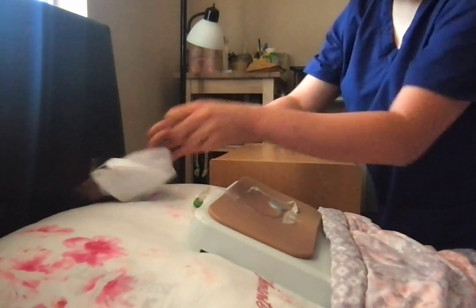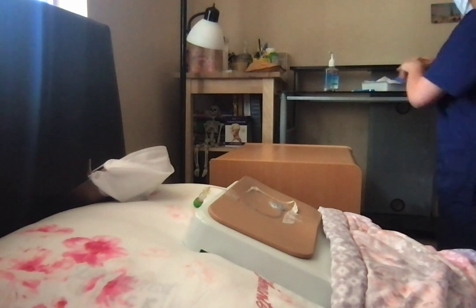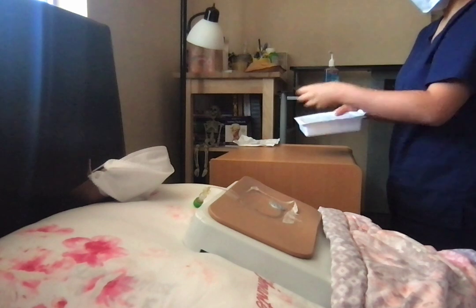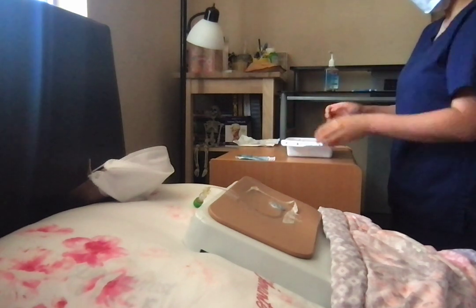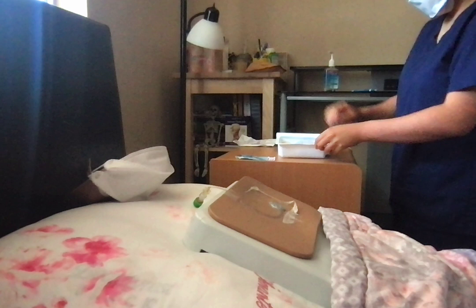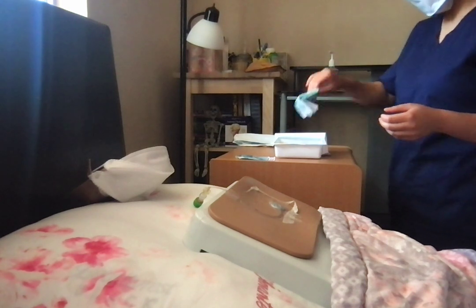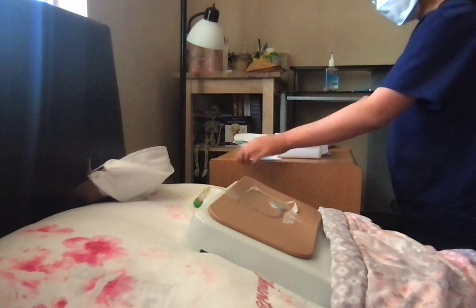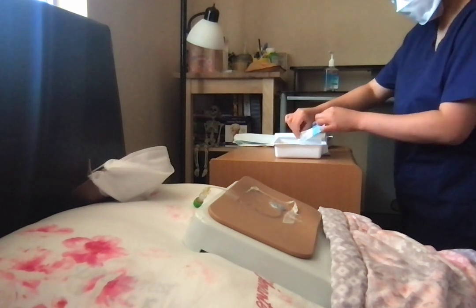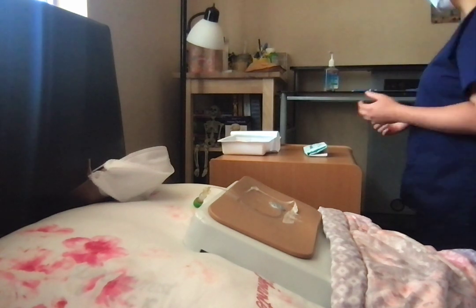Now that your head is turned to the side, Mr. Jones, I will perform hand hygiene. Now I'm going to prepare my supplies. I have my spare pair of sterile gloves, I have my bio patch, and I have my dressing kit. I'm going to open the tray and put the mask provided to the side since both my patient and I are wearing masks. I'm going to remove the sterile gloves and put the bio patch inside, making sure that the blue side is up.